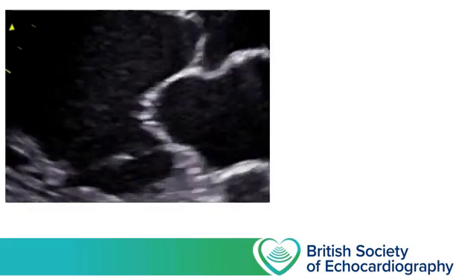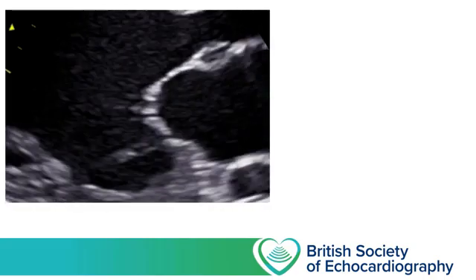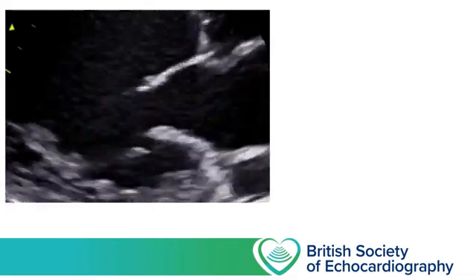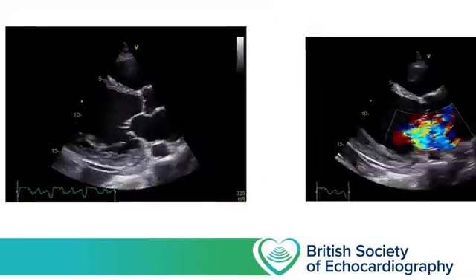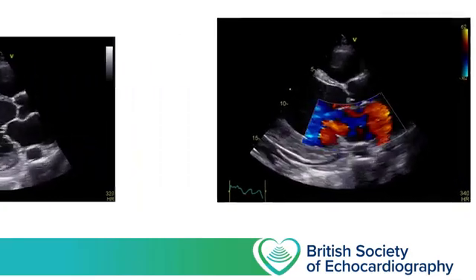During ventricular systole we can see the leaflets close and come together, but even on the 2D imaging we can see the leaflets don't actually meet. So in the normal mitral valve there should be an area of coaptation, a zone of coaptation, extending about 5 to 10 mm from the valve leaflets. And when your leaflets don't meet and there's a visible gap, you have to expect you're going to find some severe mitral regurgitation. And indeed that's exactly what we do find.